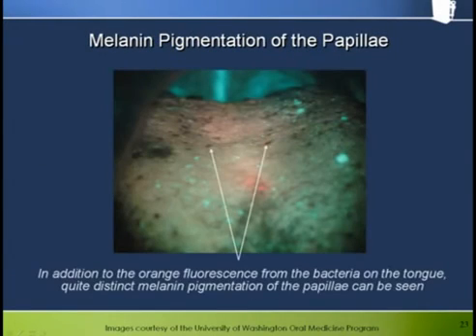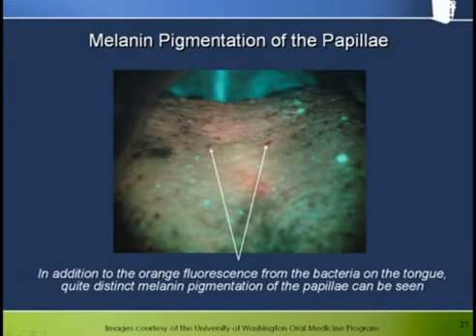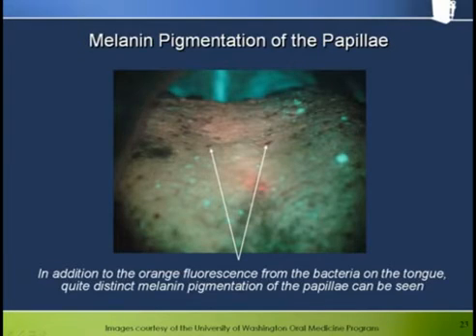In addition to the orange fluorescence from the bacteria on the tongue, quite distinct melanin pigmentation of the papilla can be seen here under fluorescence. As we might expect, the melanin pigmented papilla also appeared quite dark in white light.